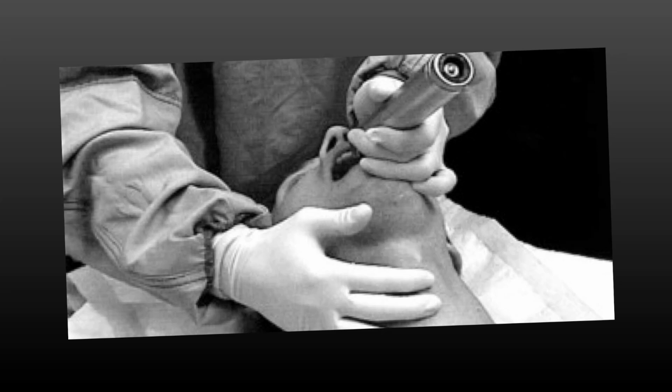We want you as the intubator using your non-dominant hand to move the glottis around or the laryngeal cartilage around on your own, and then once you have adequately identified the glottic structures by performing external laryngeal manipulation, at that point you take your assistant's hand and ask them to apply the same amount of pressure to keep the laryngeal or the tracheal cartilage in the position that you have achieved.